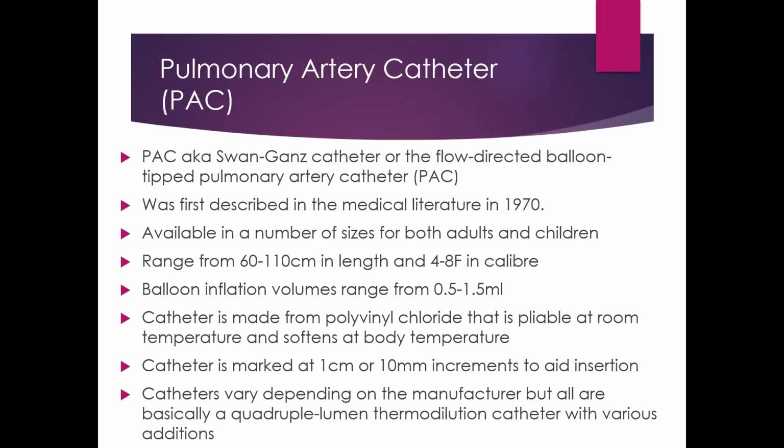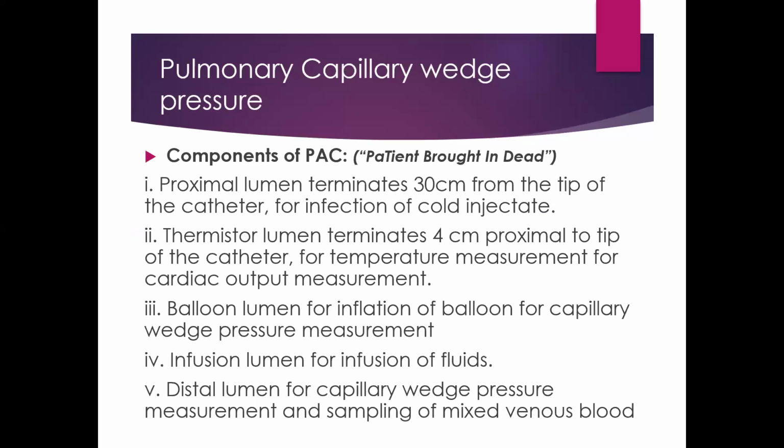So it's important for us to remember how the catheter is constructed. All right, there are about 5 components. When I was training, I had to develop this, because it was a very popular question during those days.